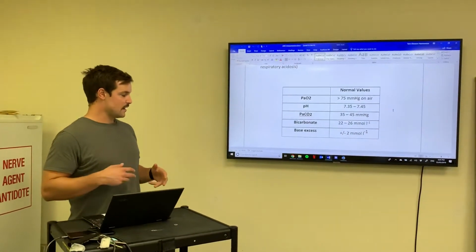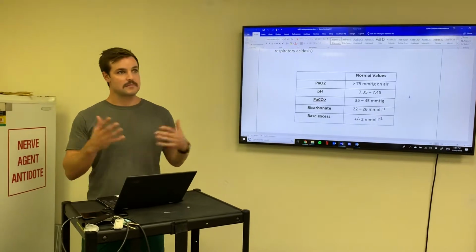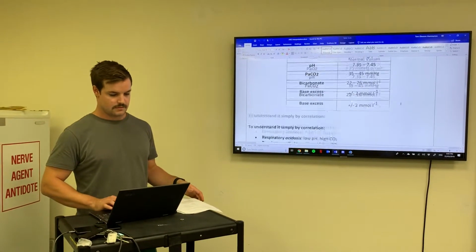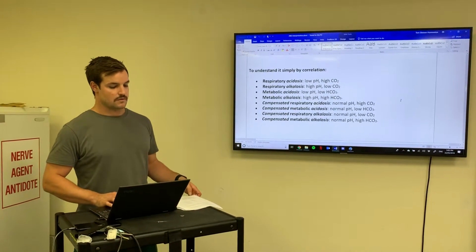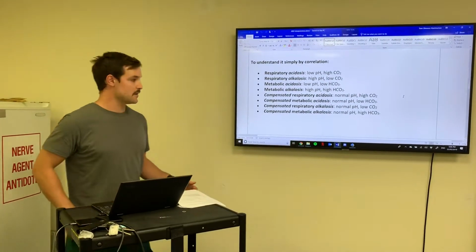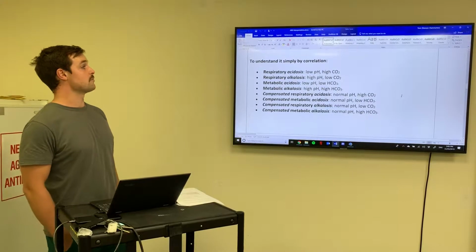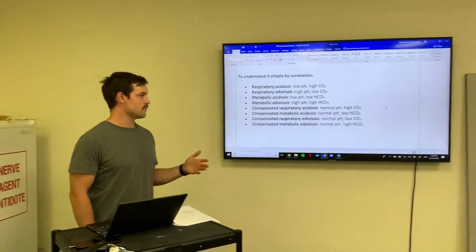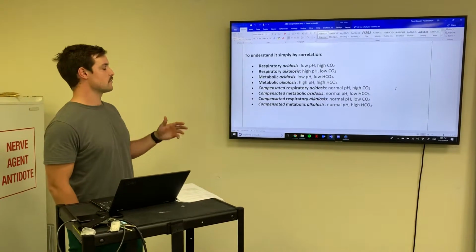To understand it simply, there's a big list, and I can put it up for you. Hang on, we'll just scroll down. We've got to read it simply in correlation. Respiratory acidosis is a low pH and a high CO2. Respiratory alkalosis is a high pH and low CO2, so the converse.